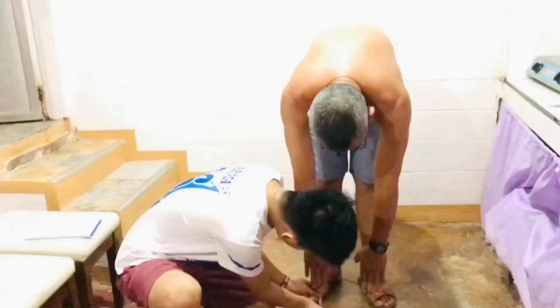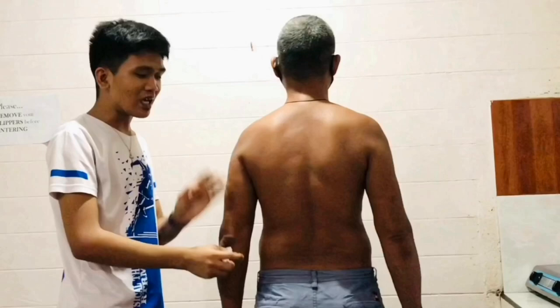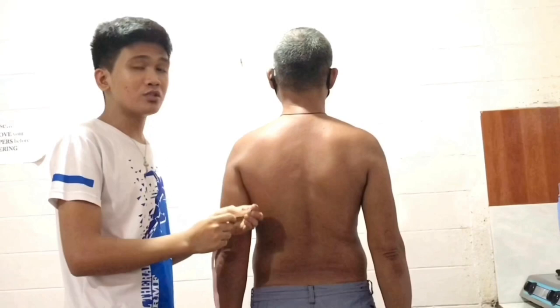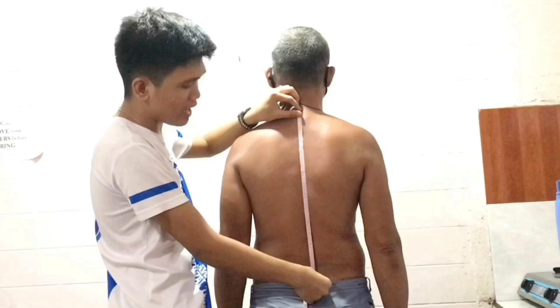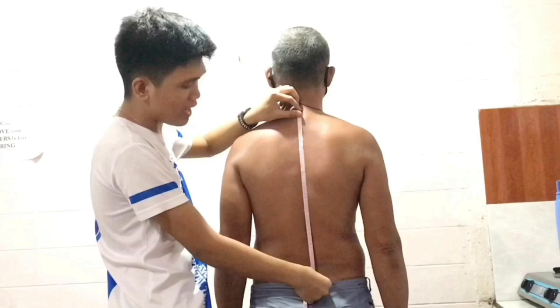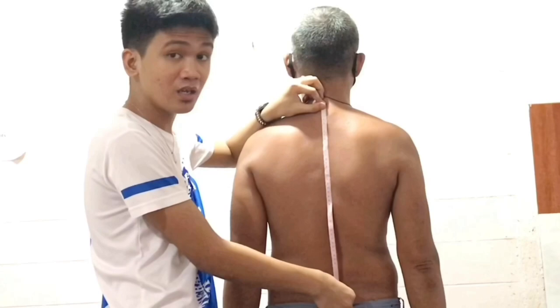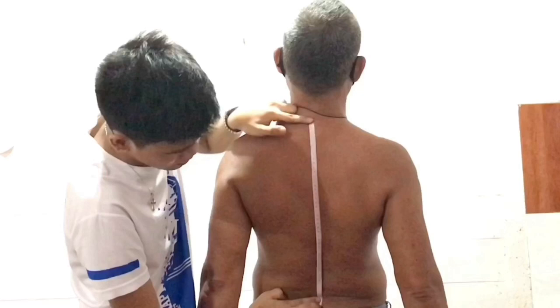Next is thoracolumbar extension. We need to stabilize the pelvis to prevent posterior tilting. We use the same landmarks — C7 and the S2 spinous process. Take the initial measurement — it's 50 cm. Stabilize, then ask the patient to bend backward slowly. Then apply passive overpressure and take the final recording.